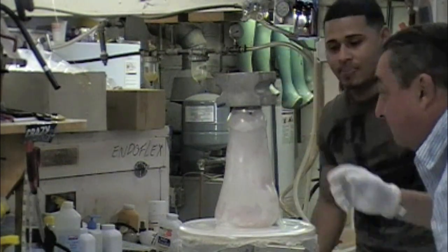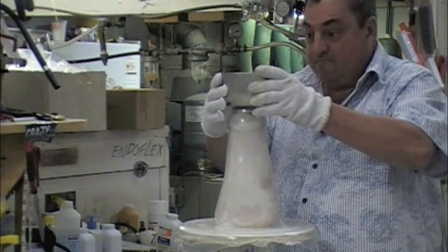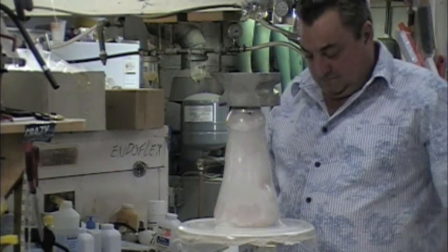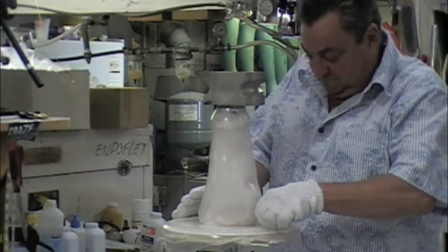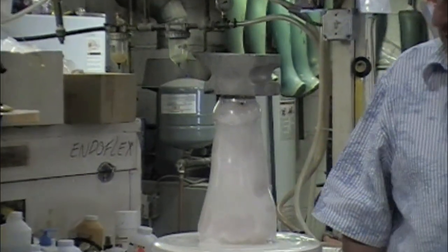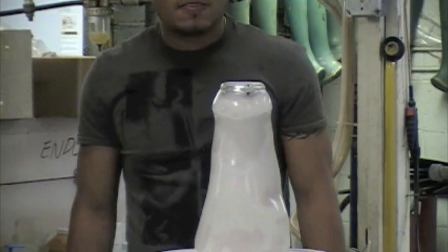And here we go — just let it go. That's going to be fast because it'll get cold fast. Voila. Now you can see what we got — all one piece.